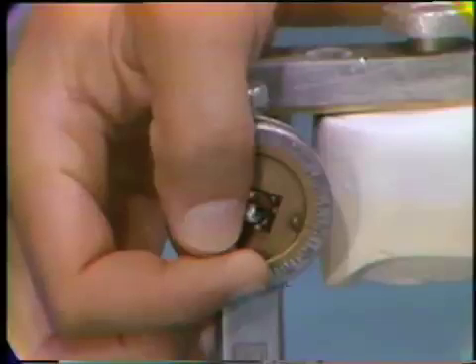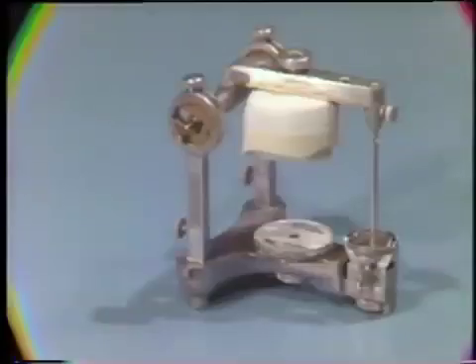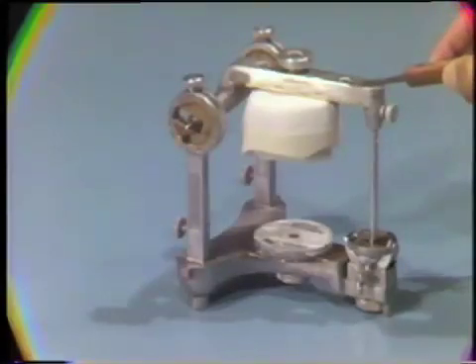Lock the instrument condylar mechanism forward, and be sure the straight incisal pin is flush with the top of the articulator.